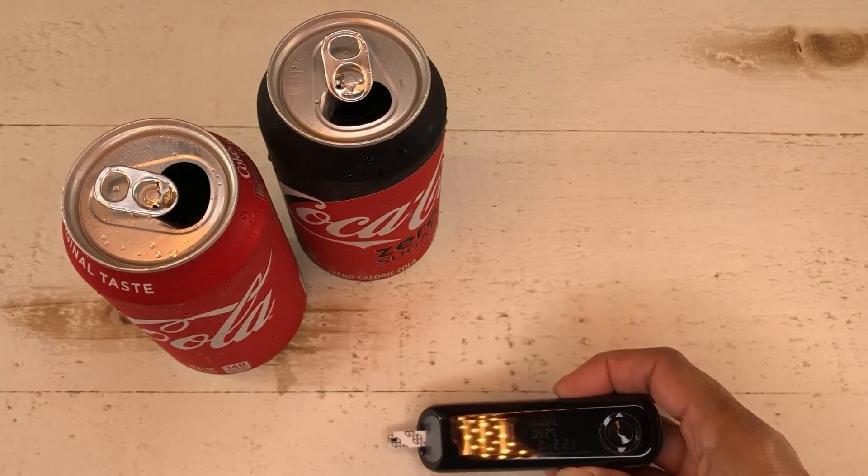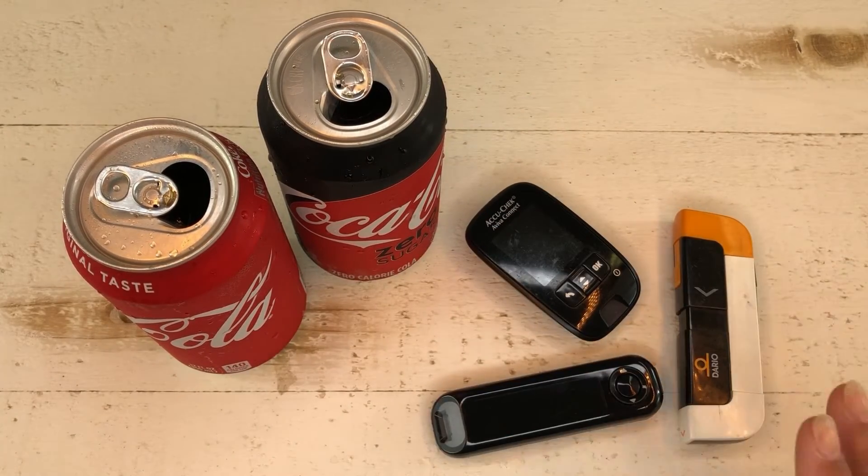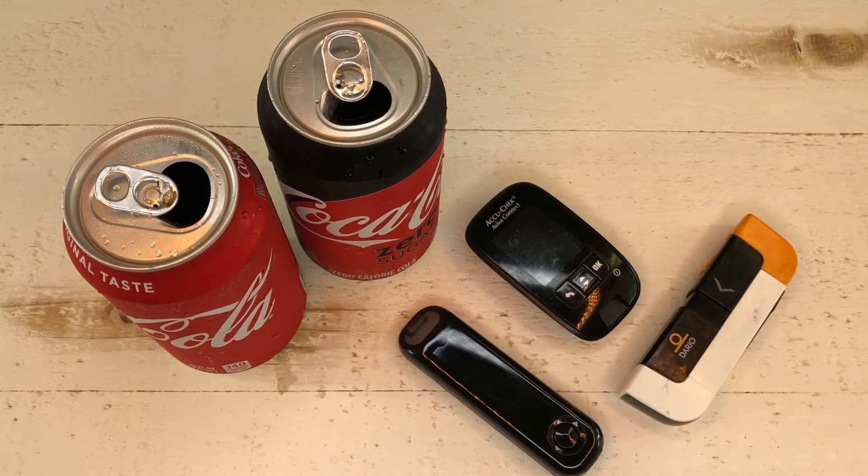So that was a really cool little test. The AccuChek, the Dario meter, and the Contour Next will all tell you if your drink is a regular or a diet drink. This trick of pulling out your glucose meter and measuring your drink has really helped me in a lot of situations - there've been times where a waiter didn't know they were bringing me a regular soda. If your insurance only allows you one or two strips a day it might not be worth it, but if strips are not a limiting factor, give it a try. Let me know how it goes and what other meters this works with in the comments below!